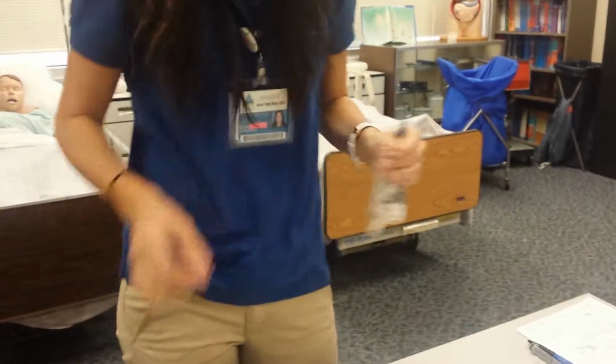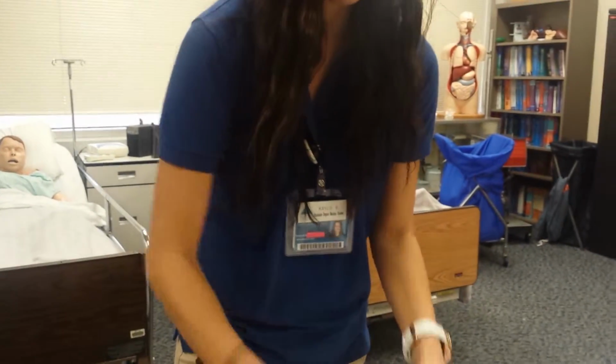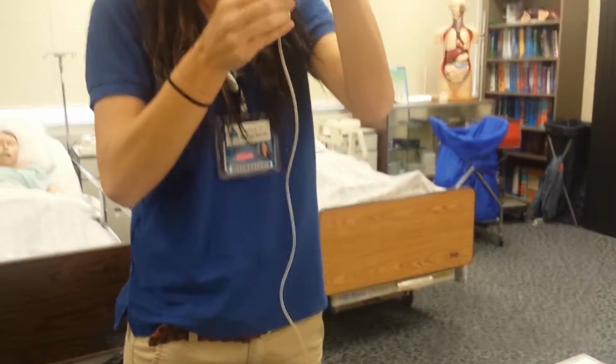Now I'm going to put this in the sharps container so I don't need the needles anymore. And I'm going to attach the secondary tubing. These are both sterile, so we don't need to cleanse. I'm going to close the roller clamp and squeeze the drip chamber.